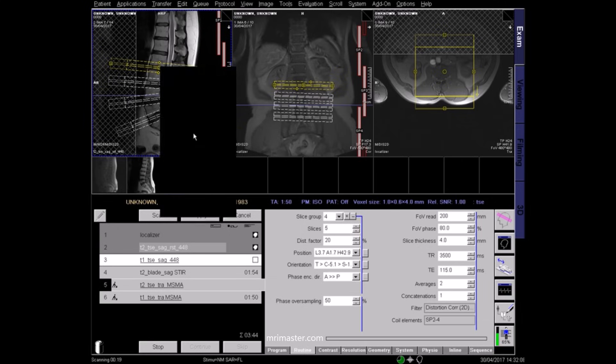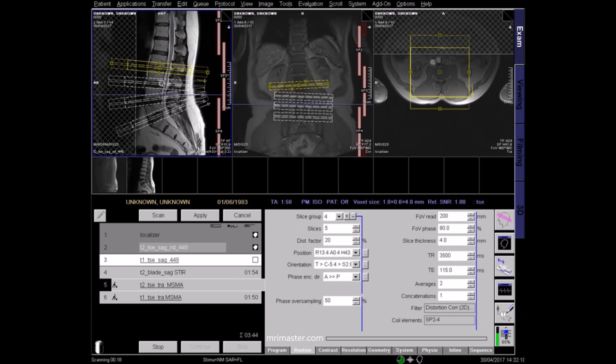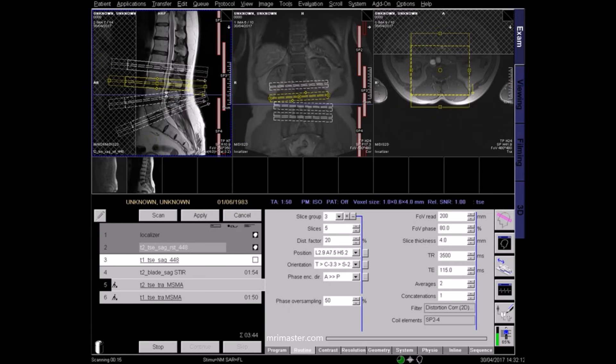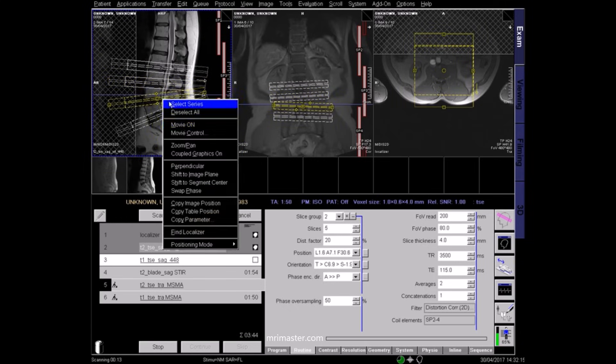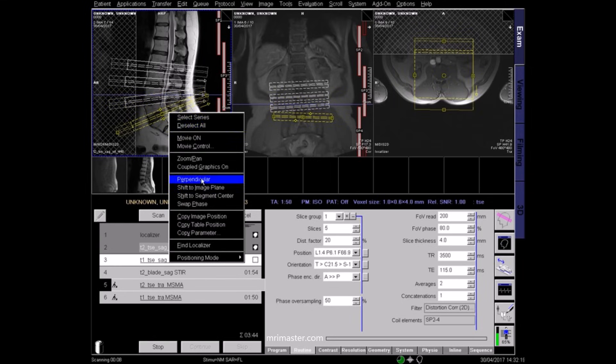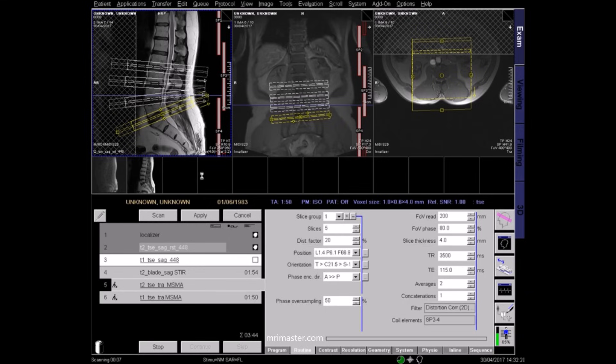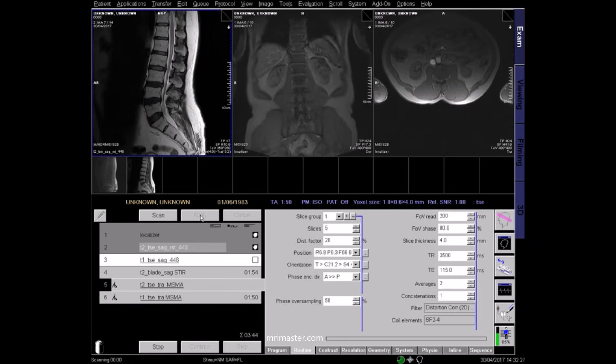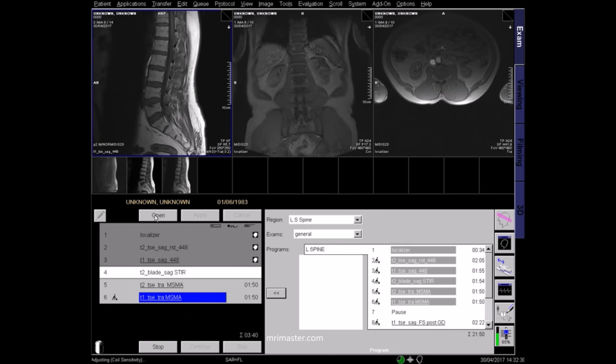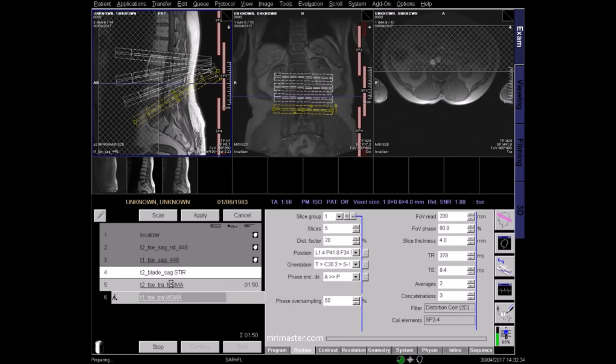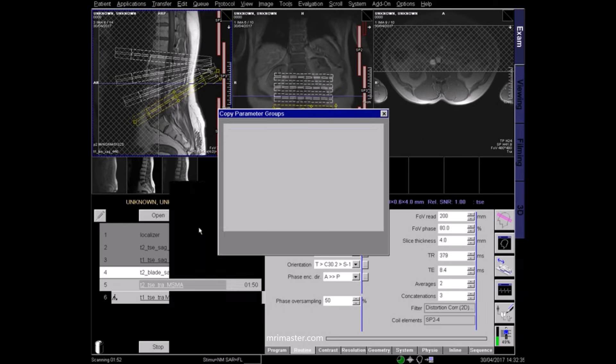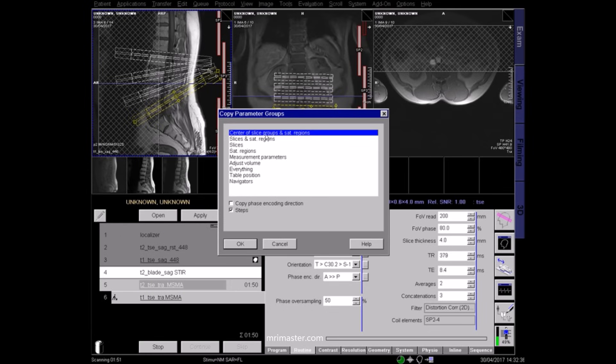An appropriate angle should be applied in the coronal plane so that the slices pass through the intervertebral joint spaces on the coronal localizer. This can be done by using the perpendicular option in the software of some scanners. Otherwise, adjust manually. The planning for the next axial acquisition can be copied from the previous axial sequence.